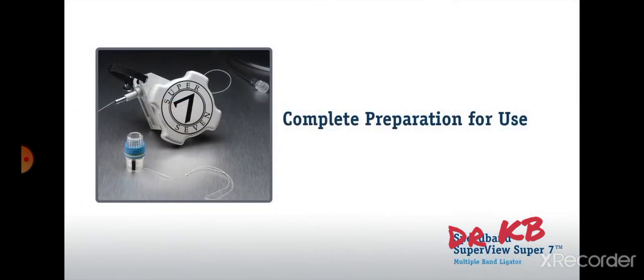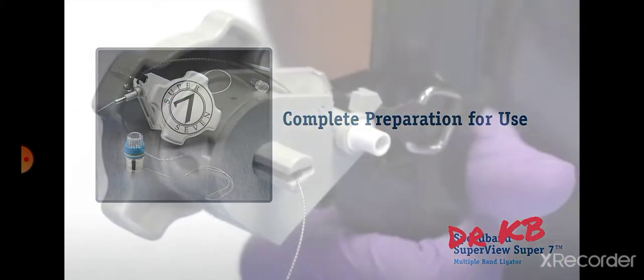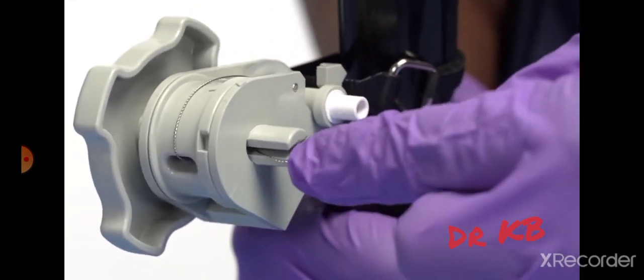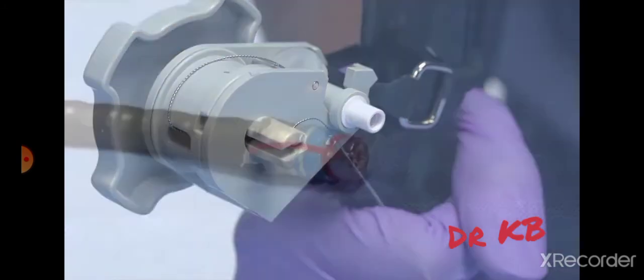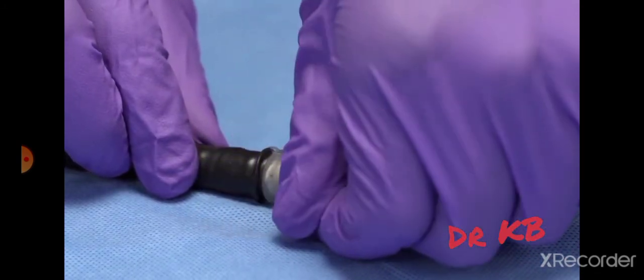Complete preparation for use. Grasp the tripwire and retract to remove the slack. Then lock down by pulling across the narrow slot. Do not over-tighten. Carefully remove the shrink wrap by hand.